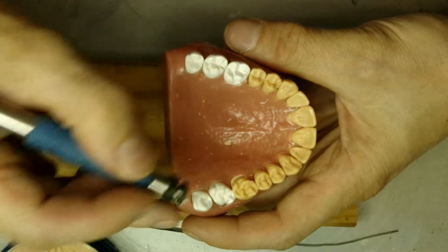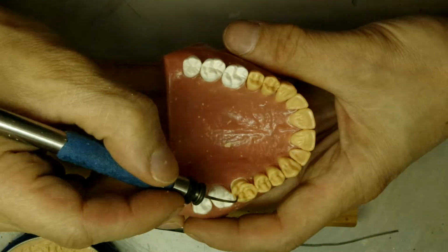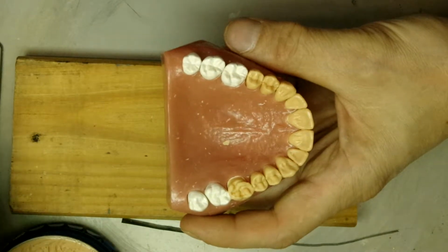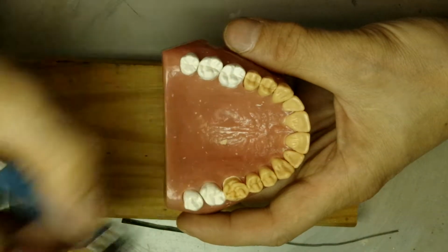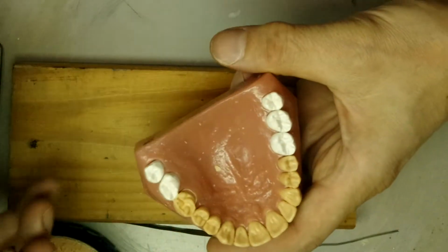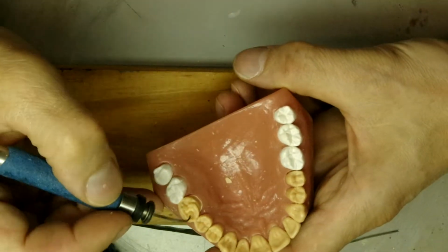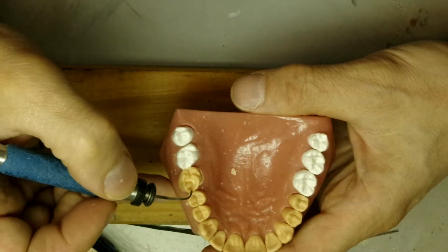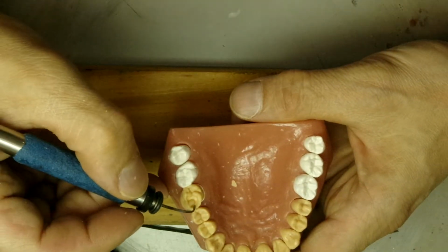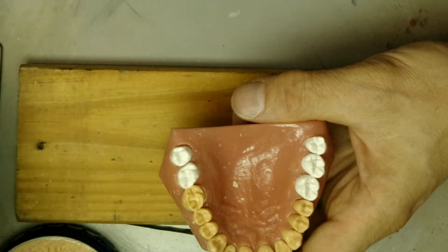And then let's give it another shot. Secondary ridge right there. Make sure it's not too hot, because you're gonna wipe everything out. Here we don't have that much space, so I think we will just puddle this in a little bit. Maybe we could probably add a little ridge right there, maybe. Let's see. Yeah, just like that.